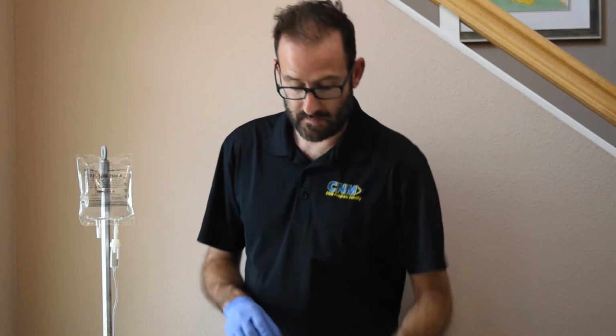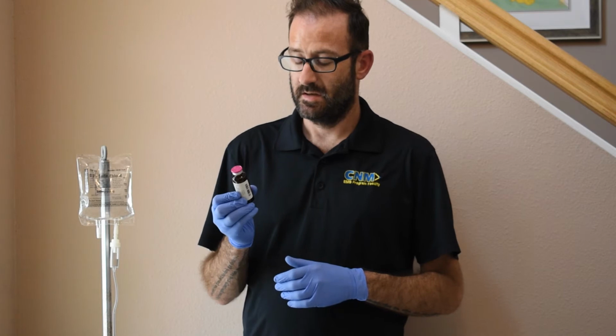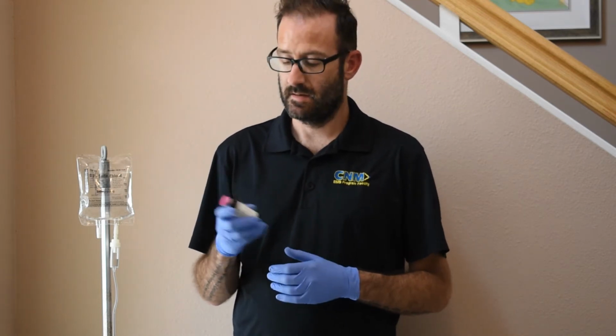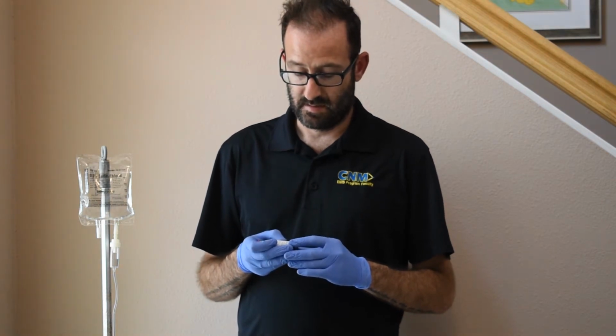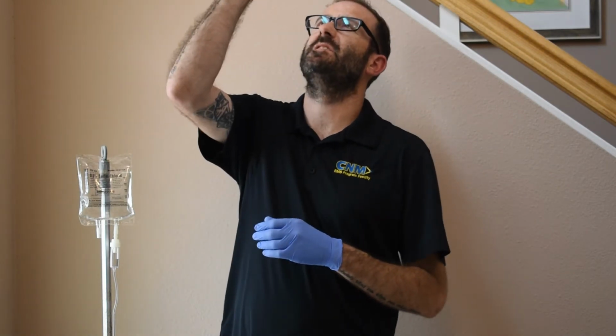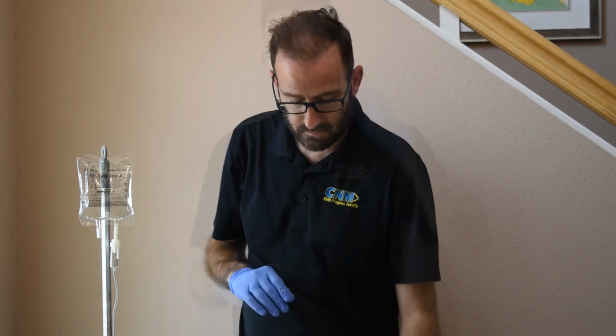I want to make sure that I have the right medication. I have Narcan. Concentration is 0.4 milligrams per 1 ml or 1 cc. I want to check my expiration date. It is in date, so I can use that. I want to hold it up to the light, make sure that I don't have any floaties in the vial.